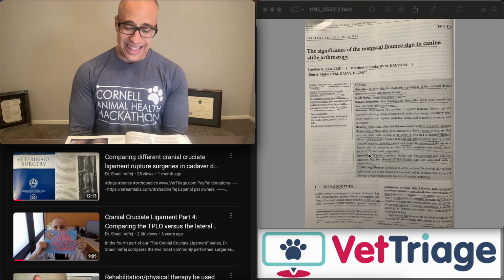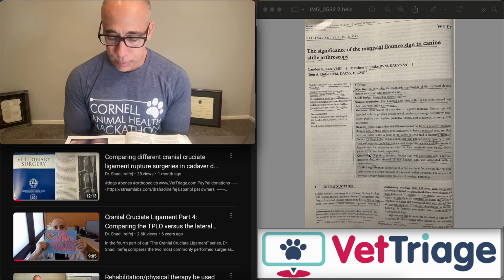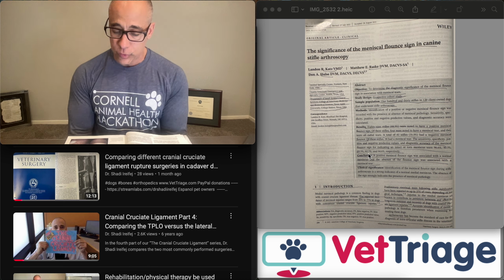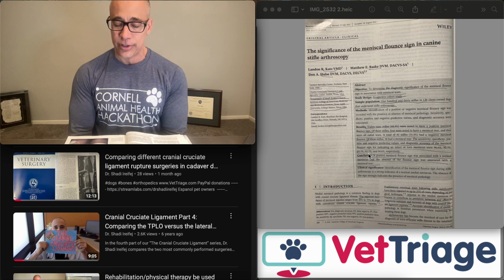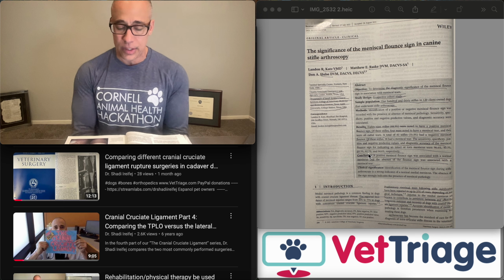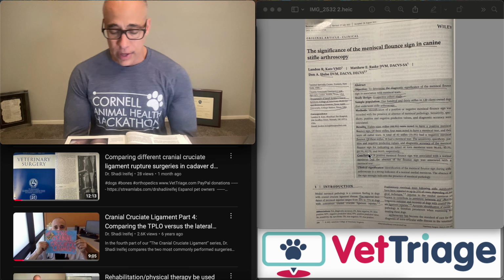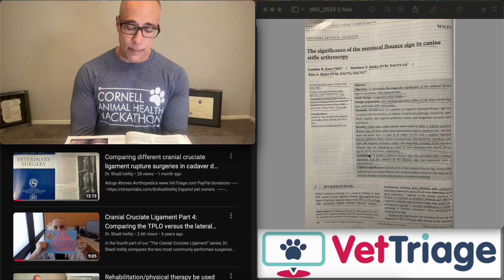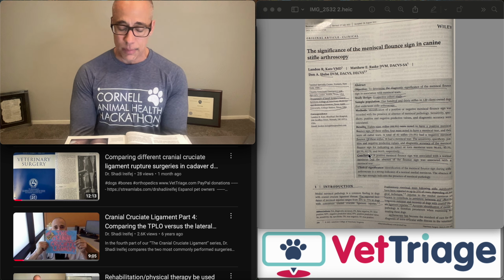In people, tight knees or poor portal placement, osteophytosis, or a certain inexperience can lead to only the free edge of the caudal pole of the meniscus being visualized. The meniscal flounce, which is a fold in the free, unanchored inner edge of the medial meniscus, is a common scope finding in people and dogs. Its presence is thought to relate to the anatomic configuration of fibers present in the meniscus that allow hoop stress to be exerted through weight bearing.